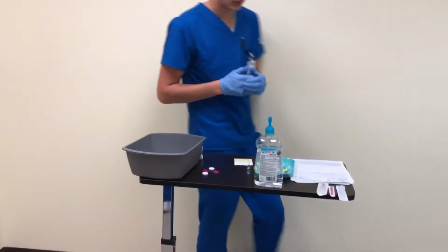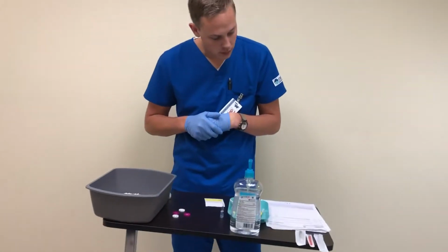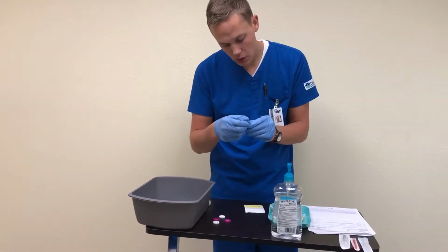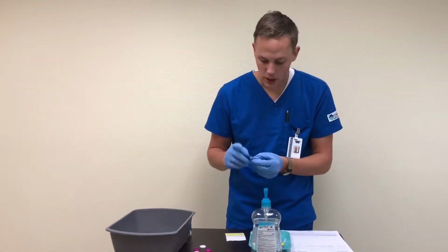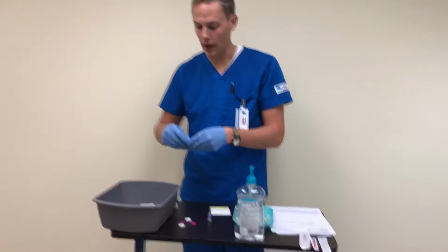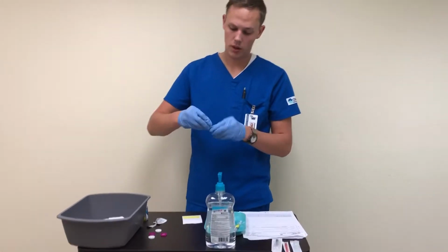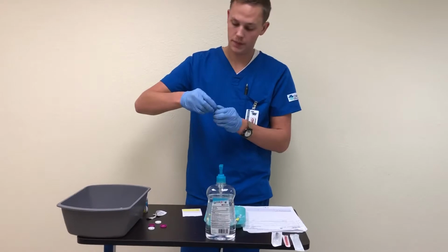All those away. So the Phenergan again, promethazine hydrochloride, that's 25 milligrams as needed, and when I went in for vitals, she was complaining of nausea, so we're going to give this. This is a 50 milligram per milliliter, so I know that I'm only going to be getting half of a mil out of this ampule. So again, just like with the vials, you want to disinfect them with an alcohol swab, making sure to get all of the top, and then where it's going to break, you want to make sure that that's clean as well.